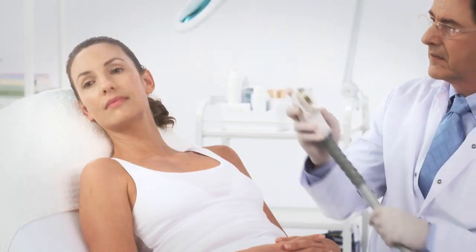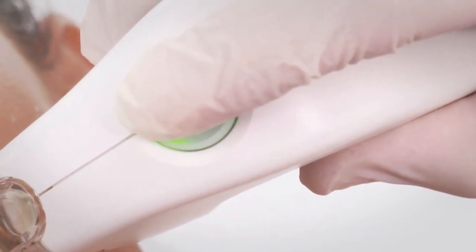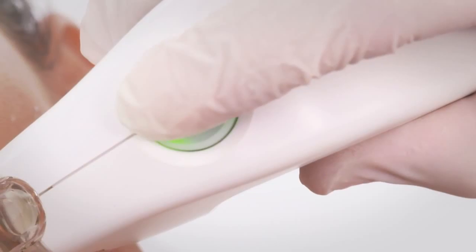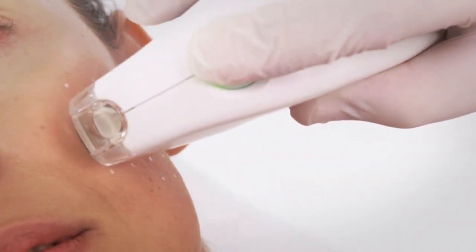Position one corner of the upper edge of the FSR tip on one of the outside dots of the grid, so the surface of the tip covers the first area to be treated. Deliver a pulse by pressing the trigger. Lift the FSR handpiece and position the same tip corner on the next grid dot so that the upper edge of the tip now covers the next area. Deliver a pulse. Continue treatment throughout the grid.